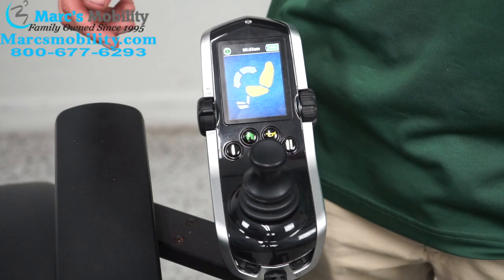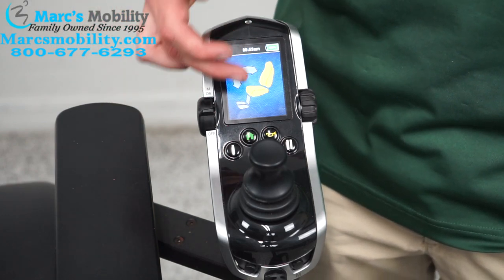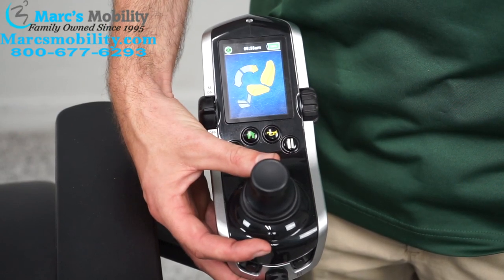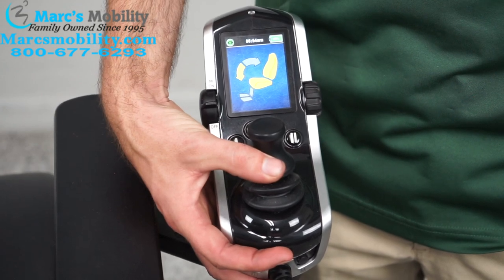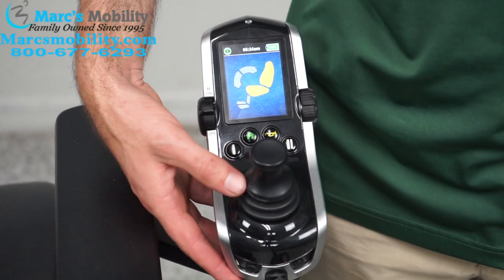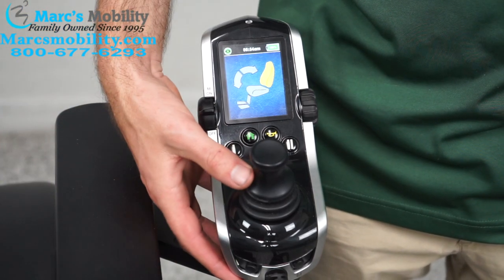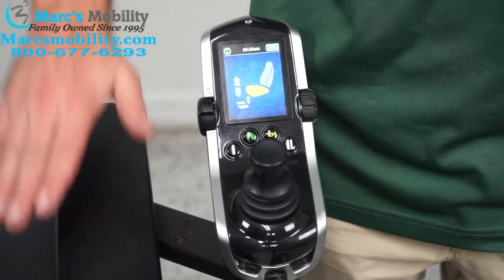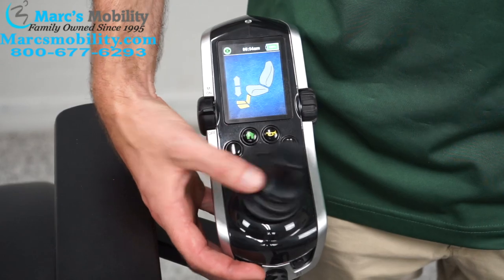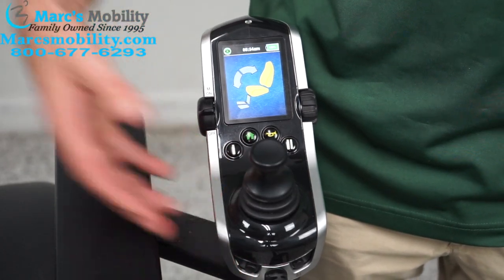Whatever is highlighted in yellow is the active function. Currently I have the bottom and the back highlighted — this is tilt, so both will tilt backwards and forwards when you push the joystick forward or back. To cycle through functions, move the joystick left or right. Going right, just the back is highlighted — that is recline, so only the back will go back. Next, just the bottom is highlighted — this is the seat lift, which goes up and down. Then the legs — this chair has electric legs that go up and down. Then back and legs together — this is the lay-down position where the legs go up and the back goes back simultaneously. One more cycle brings us back to where we started.